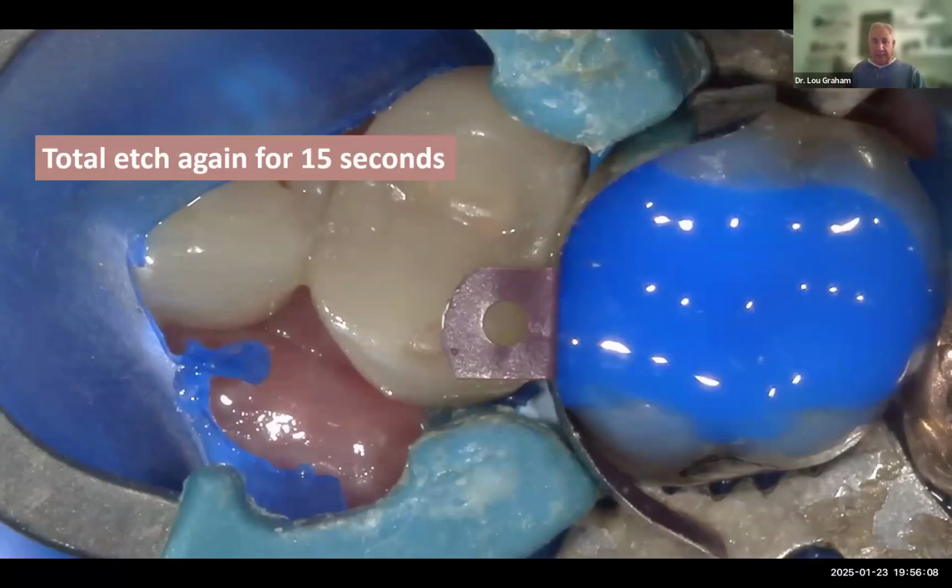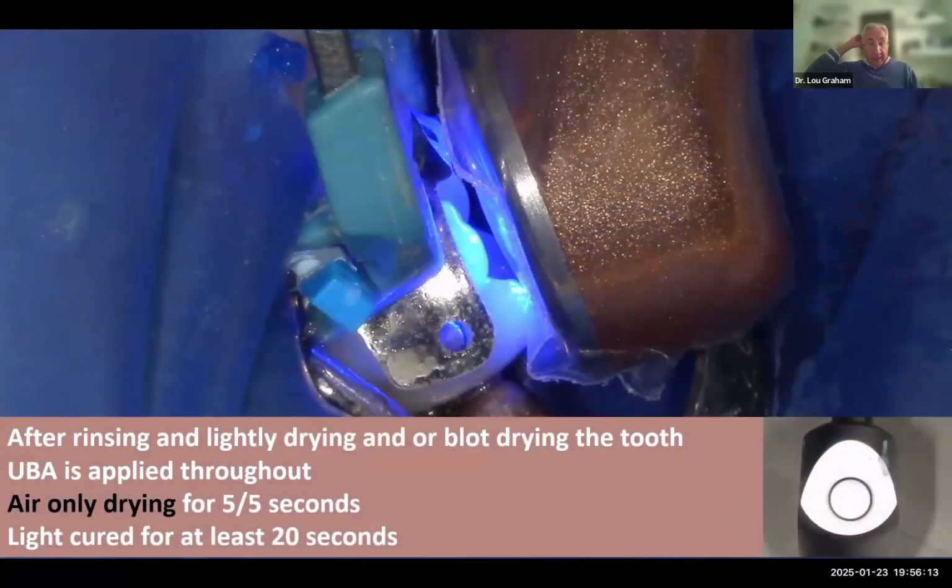So now I've got my glass ionomer, and now I'm going to do my final layering. Total etch. And then after a total etch, I'm going to rinse and lightly dry or blot dry the tooth. Whatever you want to do, but I'll lightly dry the tooth. And then I'm going to place my universal bonding agent throughout. So I'm going to scrub my universal bonding agent for the 20 seconds. That's what it says. And then once the bonding agent is on, I'm going to air dry for 5 seconds, a little lighter, and then a little heavier as I come a little closer.